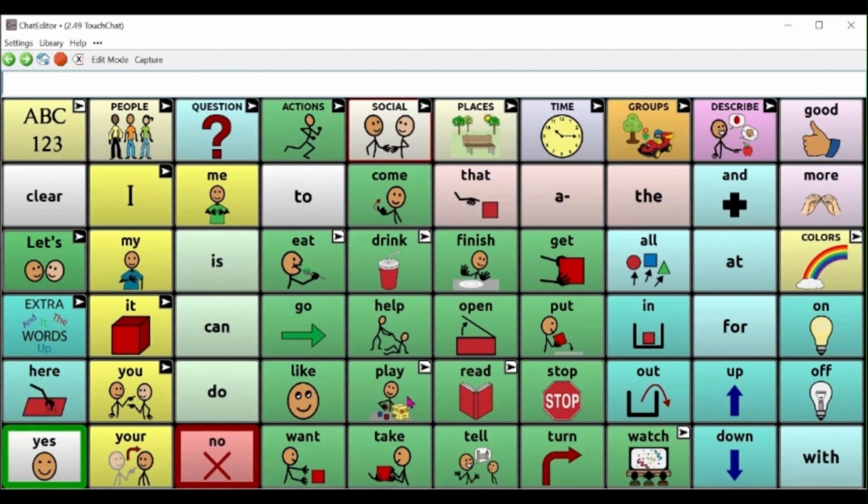And there's so much research on how this tool can really help to support that language growth and oral language as well over time. Because when children have difficulty with consistently producing intelligible speech, they need another way to practice using language to be able to get that feedback. It gives them that opportunity to play with language, to get feedback on their language.